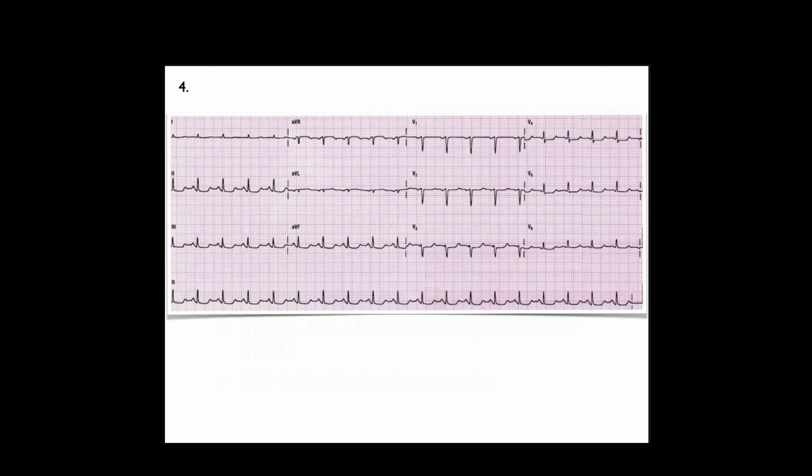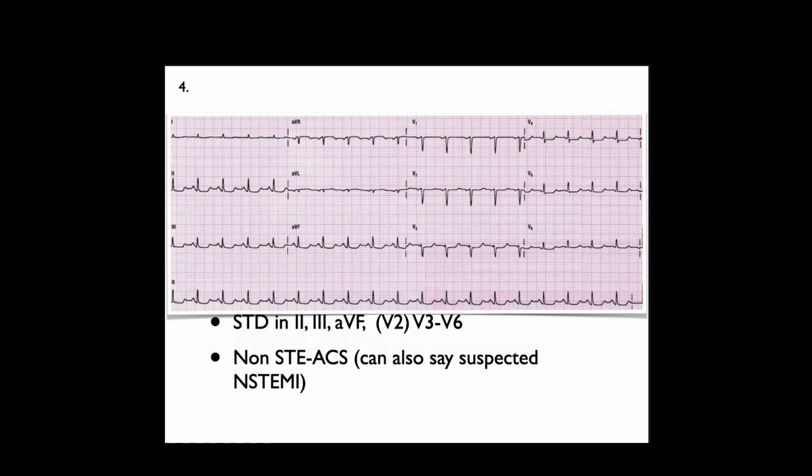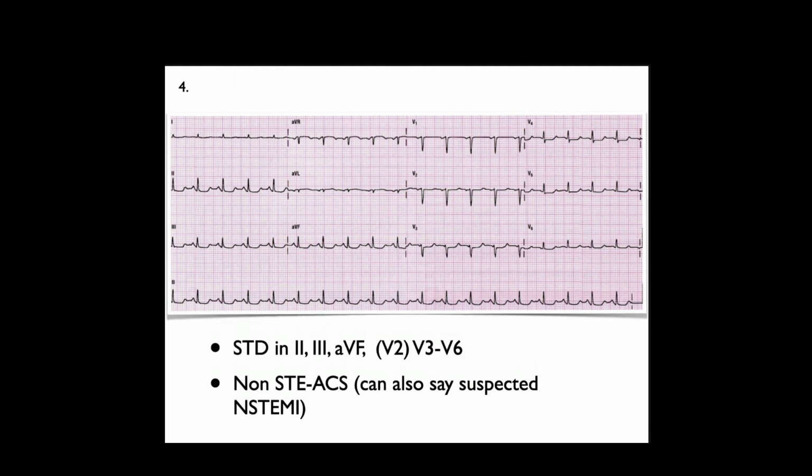Okay, Grace, next one, please. Number 4. There is ST depression in AVF, V3 through V6, that's widespread depression. I'm saying a suspected NSTEMI. Correct. Okay. Questions?